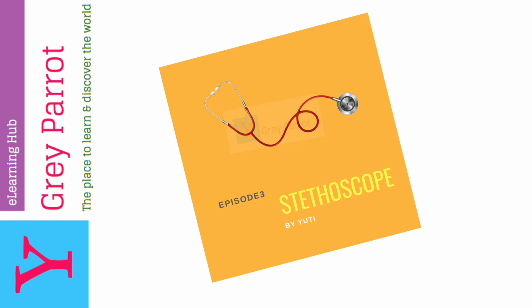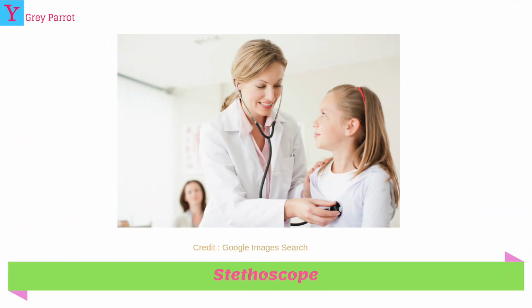Today we are gonna learn about stethoscope. Do you wonder what is stethoscope? Then look at this picture. You can see this medical equipment whenever you meet doctors, isn't it? Even with medical professionals such as nurses, GPs, etc. Do you know why they have this? Stethoscope is used to measure heart sounds and lung sounds.